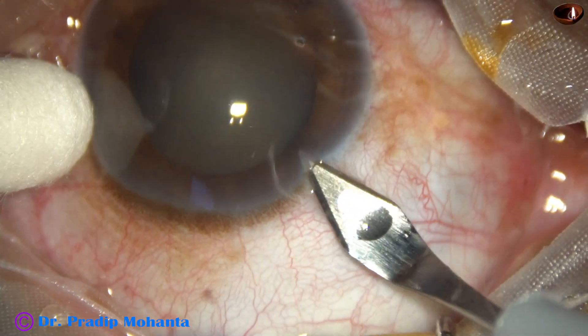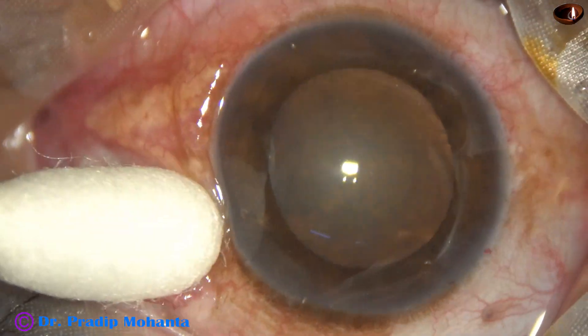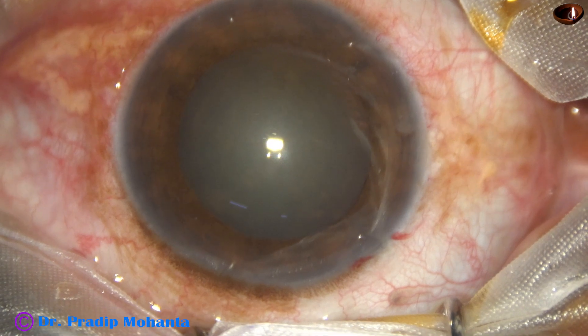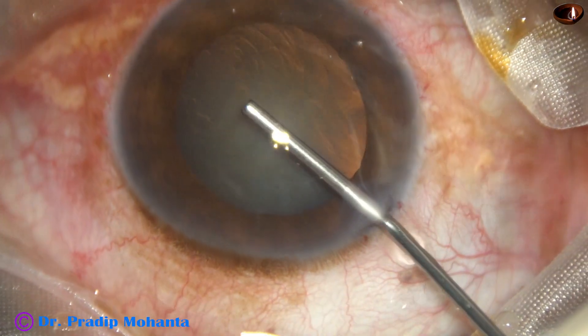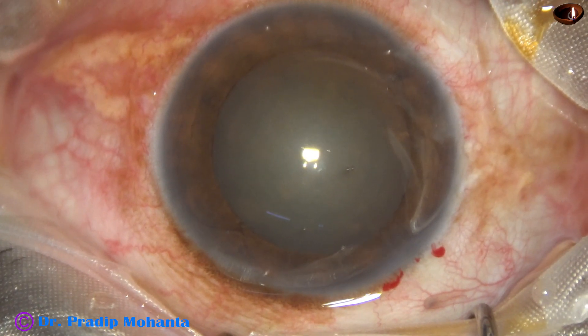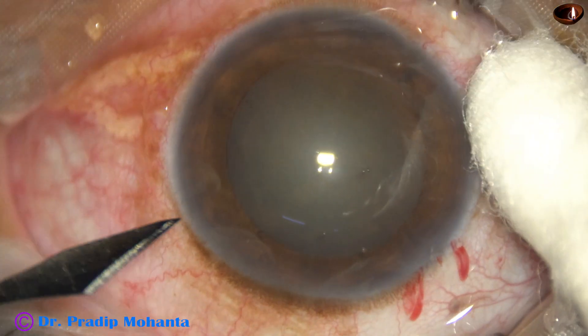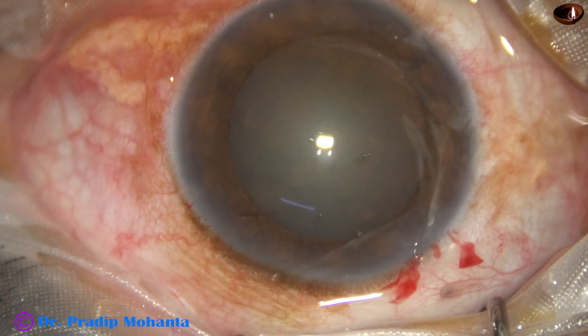This is the main incision with a 2.8 millimeter steel keratome. The anterior chamber is filled up with 2% hydroxypropyl methyl cellulose. Then a side port is made on the left side of the main incision, about 3 o'clock hours away.